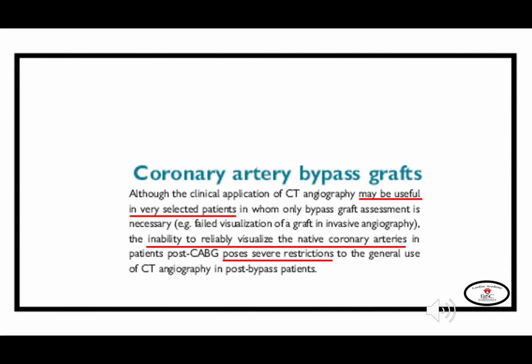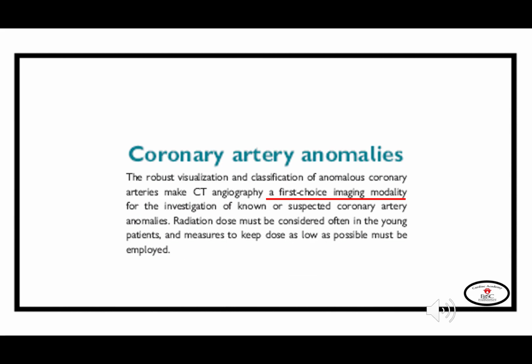For coronary artery bypass grafts, this is very useful in selected patients in whom only graft patency is necessary. However, inability to reliably visualize the native coronary arteries poses severe restrictions to its general use in this category of patients. And finally, for coronary artery anomalies, it is a first choice imaging modality.